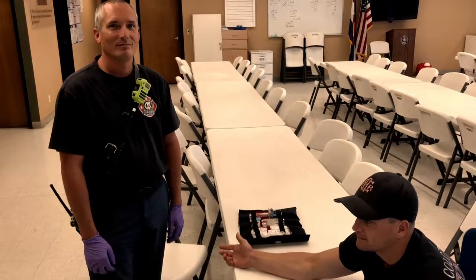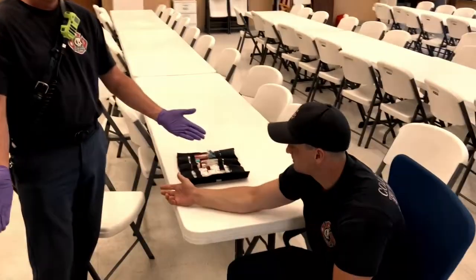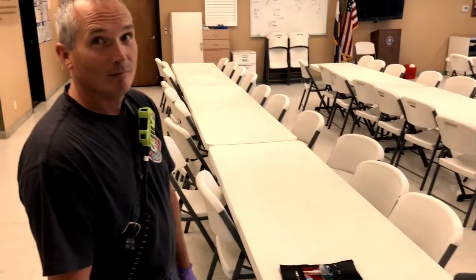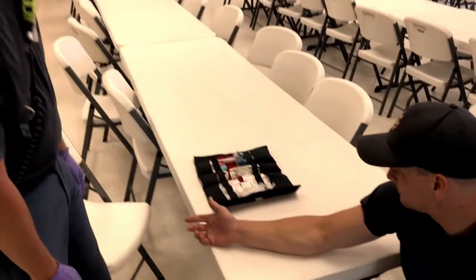Here we are. We're going to demonstrate a live IV. Lieutenant Mesner, Firefighter Werner have graciously volunteered to do this. They're under a lot of pressure because we're videoing them. Here we go, live IV.